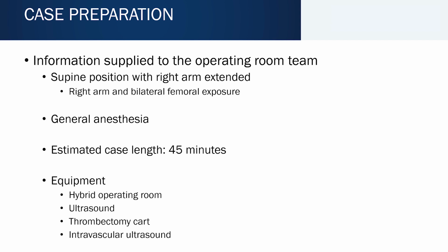We requested general anesthesia. This procedure could be performed under local anesthetic with or without monitored anesthesia care. However, given that this is potentially uncomfortable and the need for relatively high-end imaging, the decision was made that general anesthesia would be the most comfortable for a relatively low-risk patient for anesthesia. The estimated case length was 45 minutes.